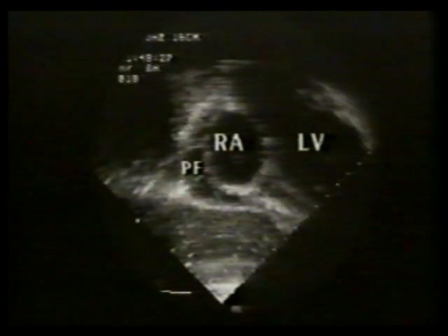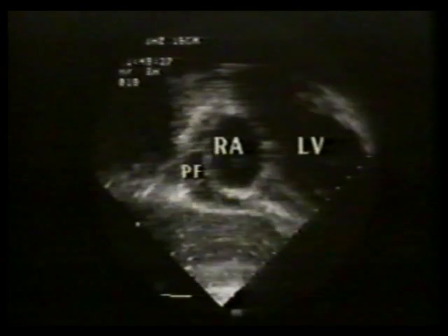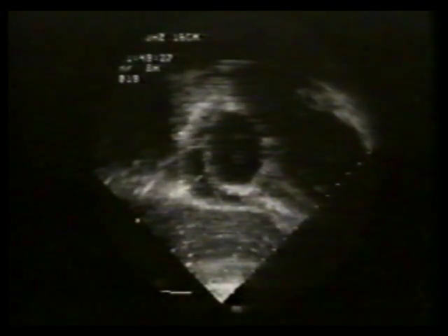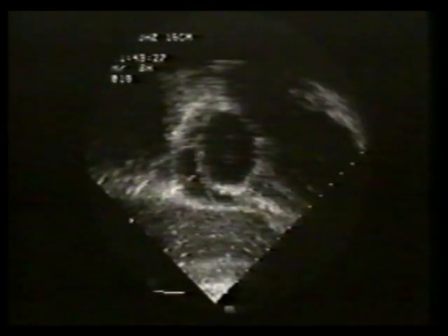This patient had signs of early tamponade, and 600 cc's of hemorrhagic fluid were removed by echo-guided pericardiocentesis. This is a subcostal view obtained after the procedure. Attention is focused on a small pocket of residual fluid around the right atrium. Multiple fibrin strands traverse this pocket.